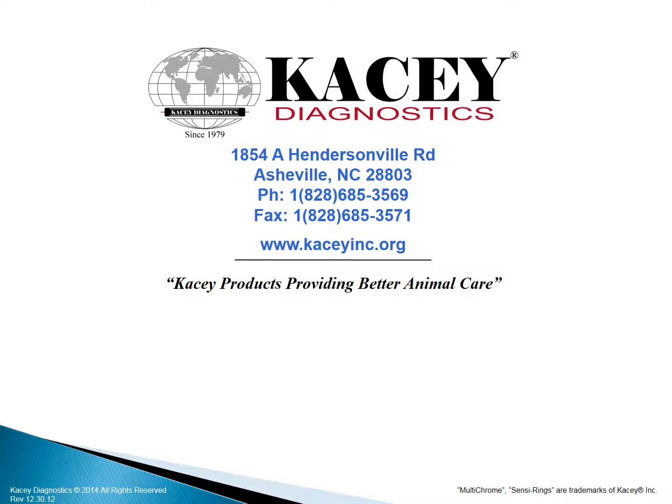And this concludes the second part of the Culture and Sensitivity Training Program. We are confident that with the tools provided, you will become proficient at sensitivity testing with the SensiRing system. Thank you for listening.